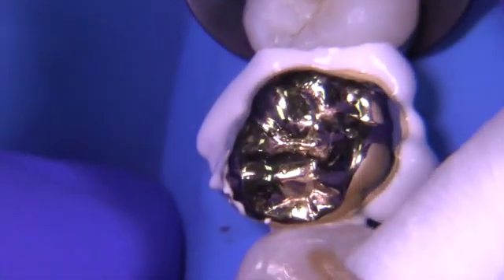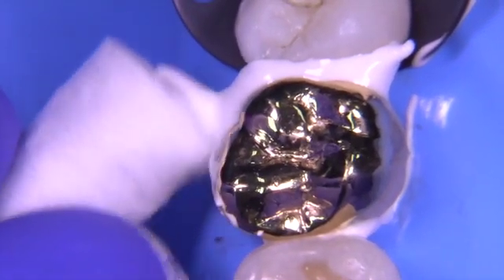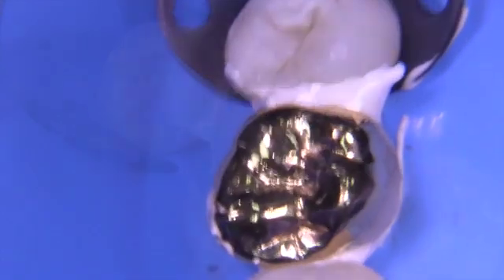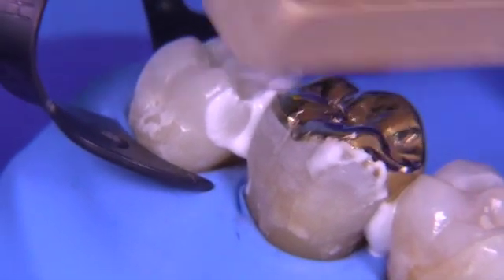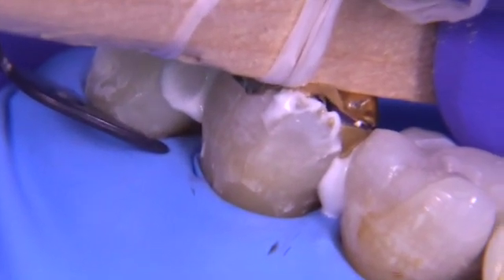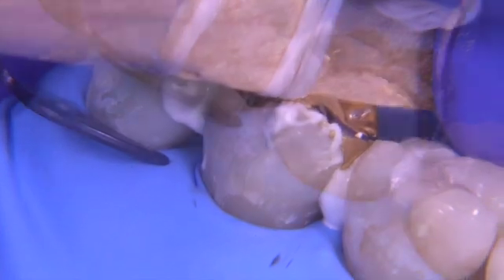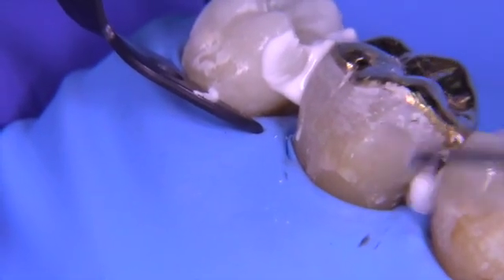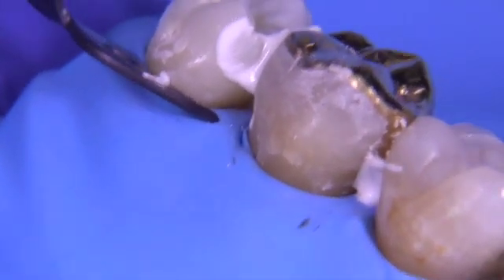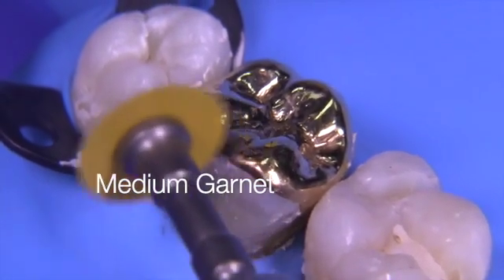Have the patient bite down on the double bite stick, then remove any excess cement and verify that the margins are 100% closed. I like to remove a little cement so I can visualize the margin, then have the patient bite down hard again on the bite stick to forcefully place the casting into complete cementation position — fully adapted to the enamel. Then make sure all the margins are clean and in a particularly well-sealed condition.